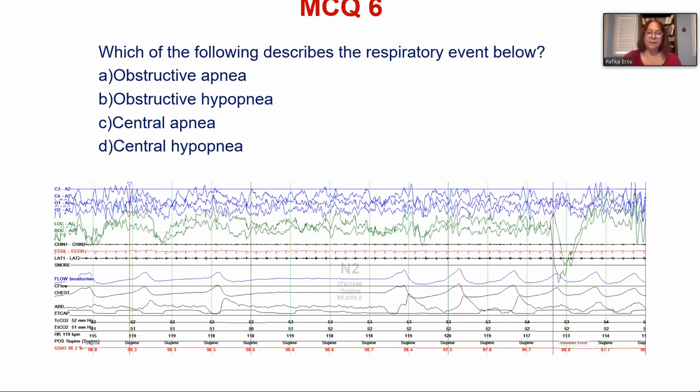And then you also look at the saturation, whether the saturation decreased or not, because we don't quite know the length here, but I can confirm it's more than 2 breathing cycles of that child. And the saturation went down to 87 following the event.